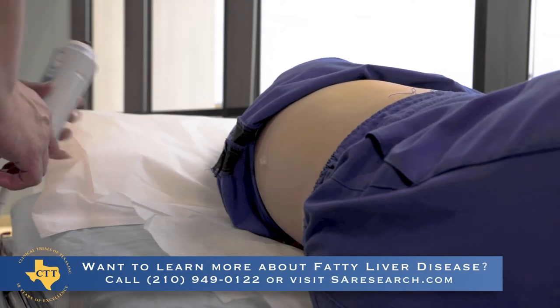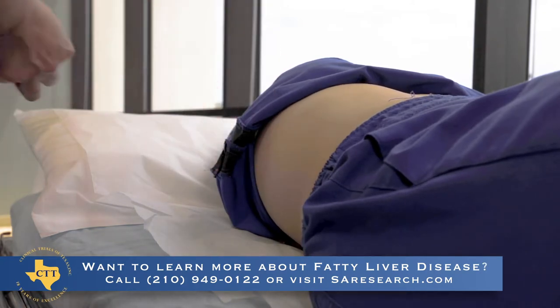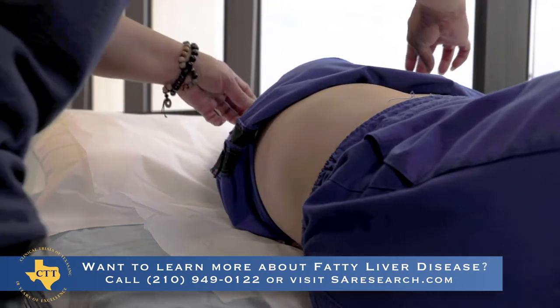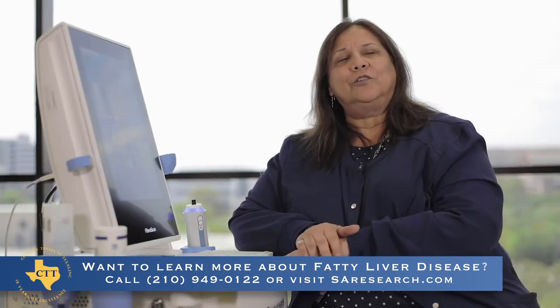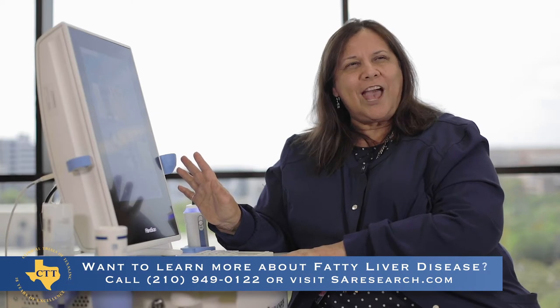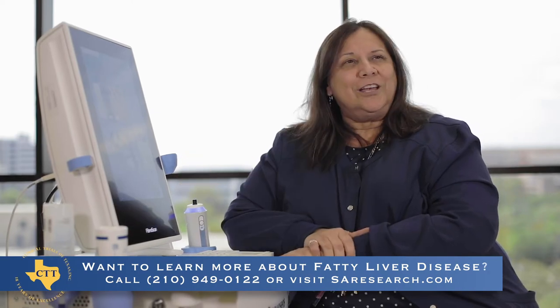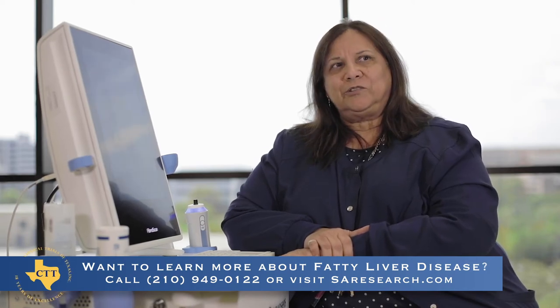Right now this patient would have a pretty significant amount of fat and a very little amount of scarring, thankfully. We don't want the fat to progress into scarring. Of course, the only way to definitively diagnose fatty liver disease is by either an MRI or a liver biopsy, but this is going to point us in the right direction. Here at CTT, we have several studies for simple fatty liver all the way to the more serious cirrhosis.